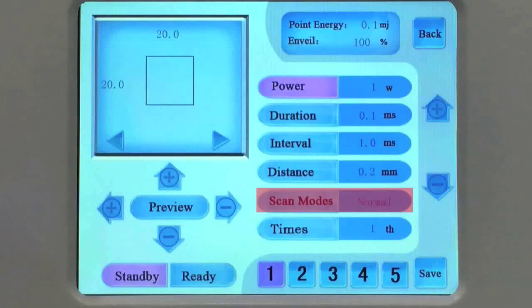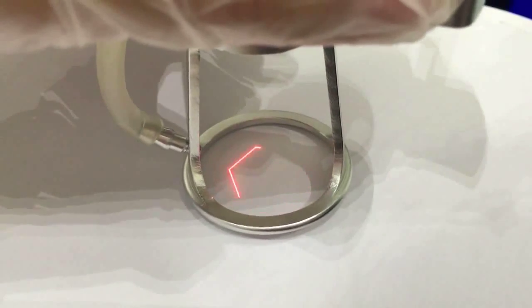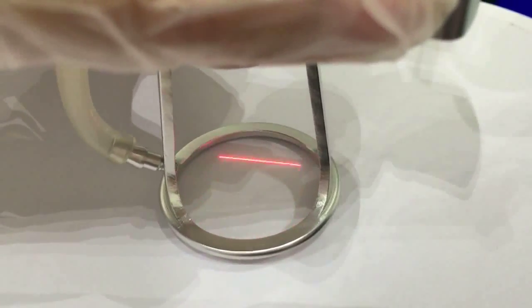Scan modes: Normal, Mid-split, Random. Times adjust range from 1 to 20. There are seven shapes available to choose — touch preview. There are: line, square, rectangle, triangle, hexagon, round, oval. Size is adjustable. Save it for treatment.